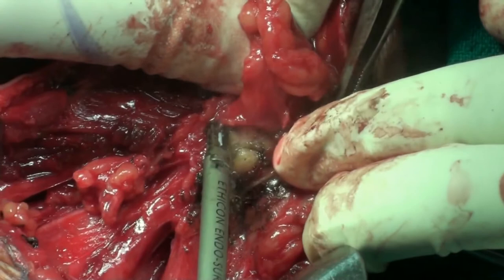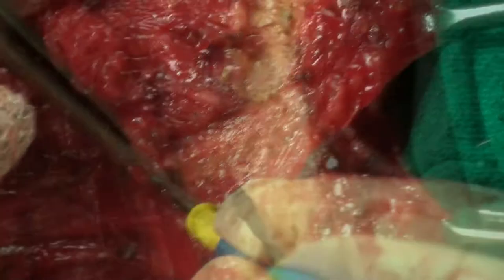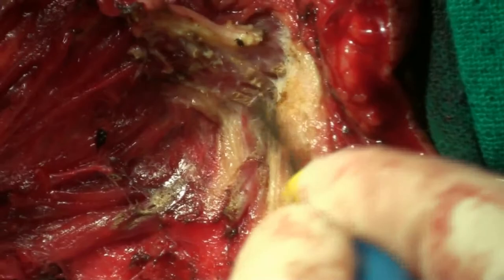Because we can't figure it. It's not a part of the relationship. It'll be about 2 centimeters. I'm fine. Alright, there you go. The nerve goes with you, Siddharth. But Erb's point is a very important landmark for finding out the accessory nerve.